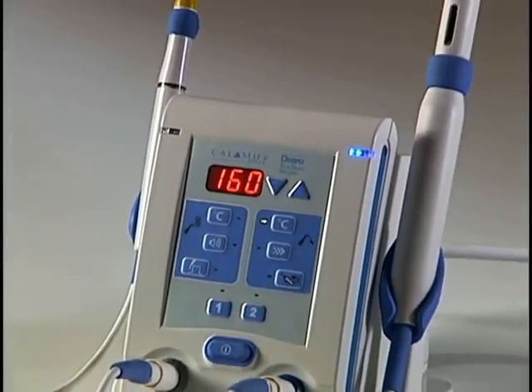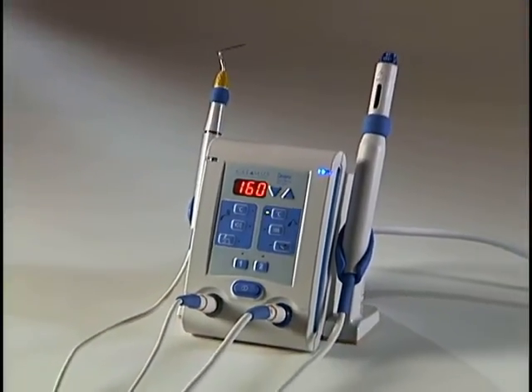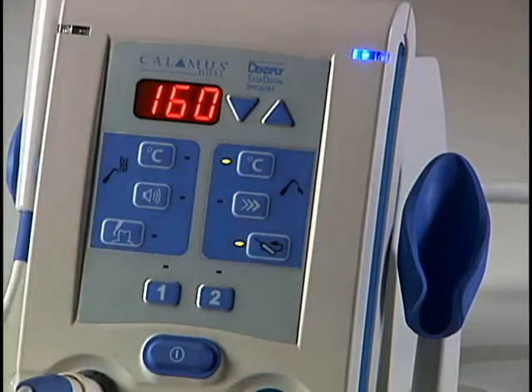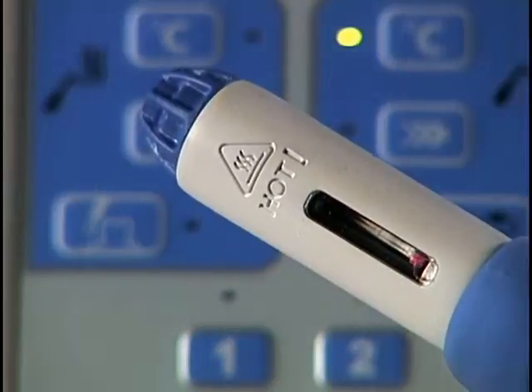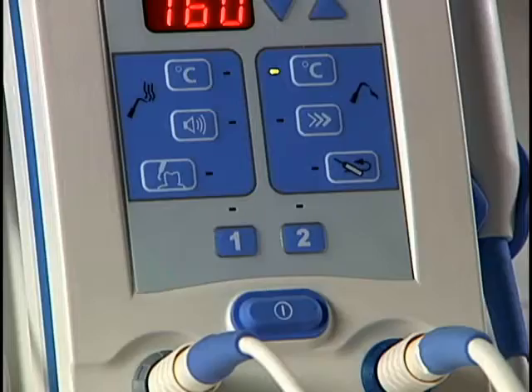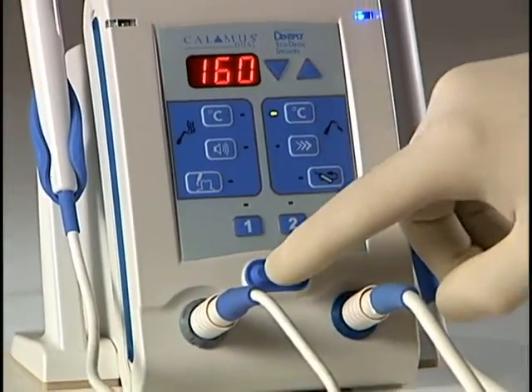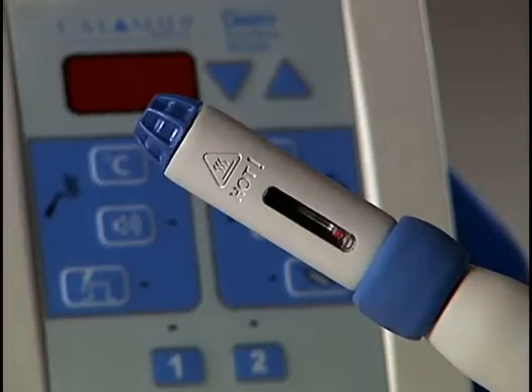Prepare the flow handpiece for loading by ensuring that the plunger is fully retracted. Press the return button on the control unit. The plunger will return to its original position. Wait until the motor is stopped, then turn off the power and allow it to cool for 60 seconds.